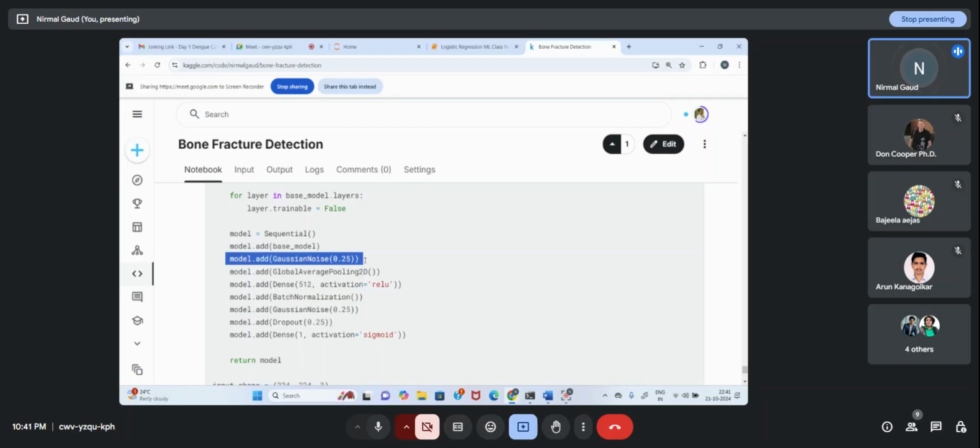Because I have seen in medical data, you can't claim that this architecture is enough for breast cancer, also for brain tumor, also for chest x-ray. No, no, no, not at all. You can't claim. Different data, different architecture. Who knows on what you are going to get the success. So that's what we can try.